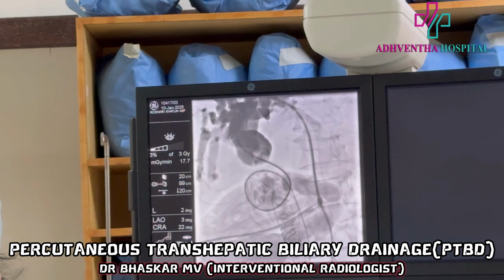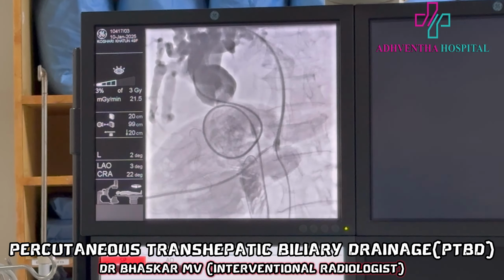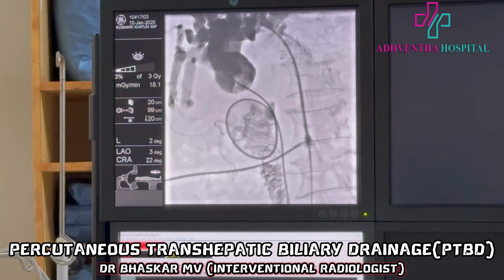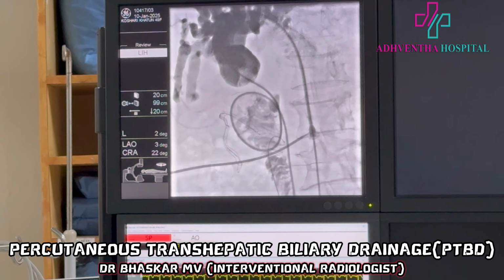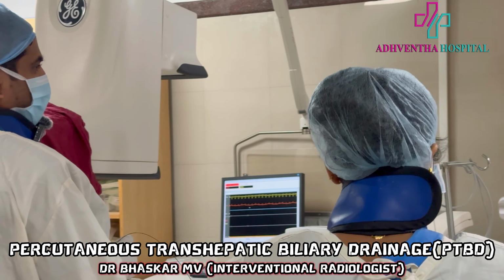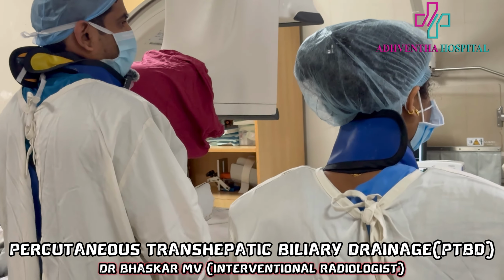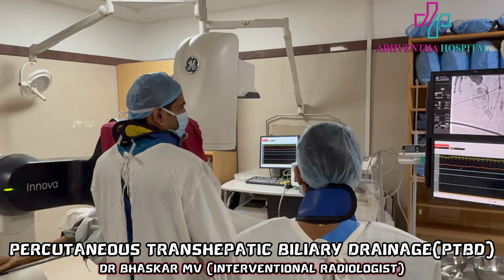Then it's going distally. Okay, can you show down? Come to AP. Somehow it's going down and again, you can guide.